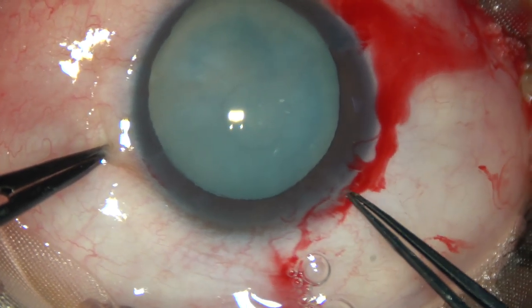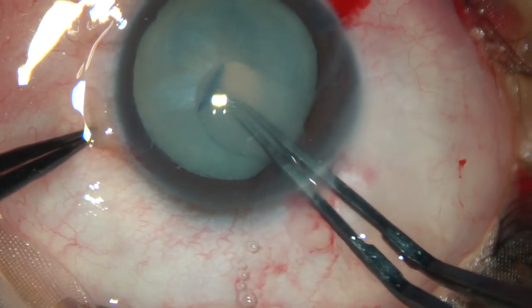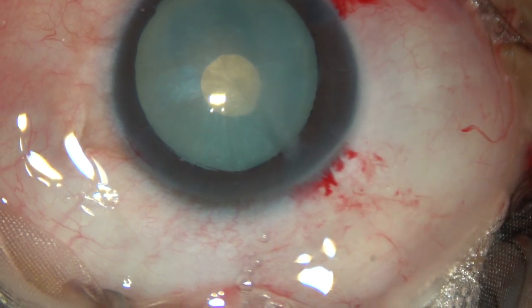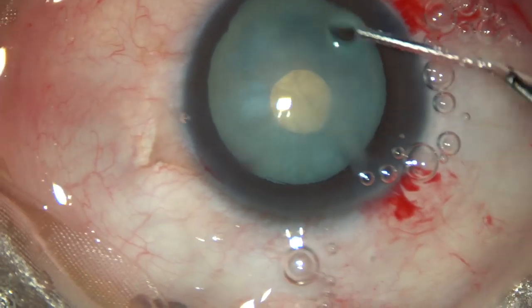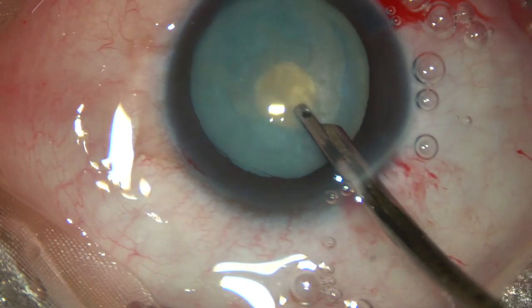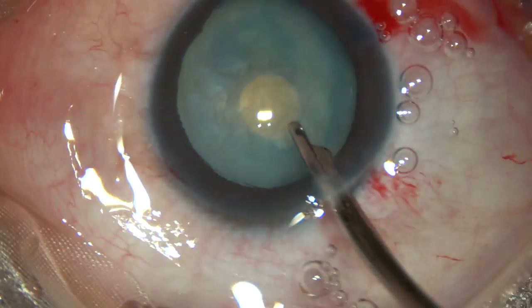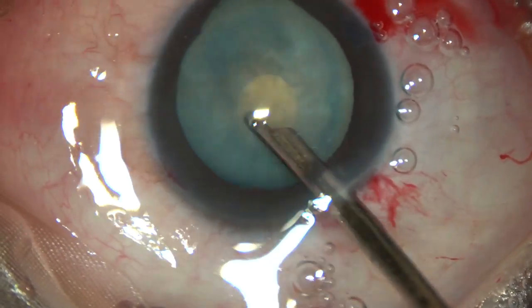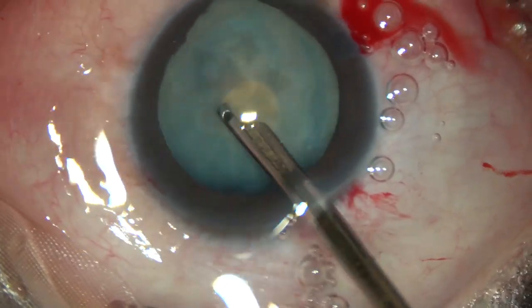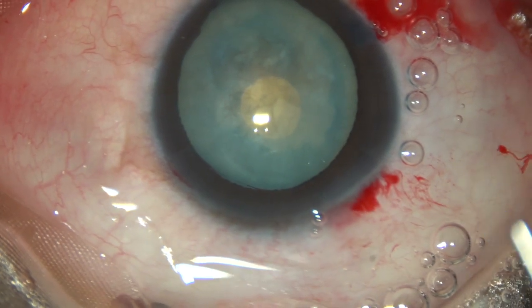Since there is positive pressure inside the lens, I decided to do a small rhexis first, followed by an optimum-sized rhexis. The small rhexis is made through this small opening, and some superficial cortical lens matter is removed, so the intra-lenticular pressure gets nicely reduced. Once the intra-lenticular pressure gets reduced, the tendency of the rhexis to run to the periphery is no longer there. So this is a nice technique to do rhexis in intumescent cataracts.